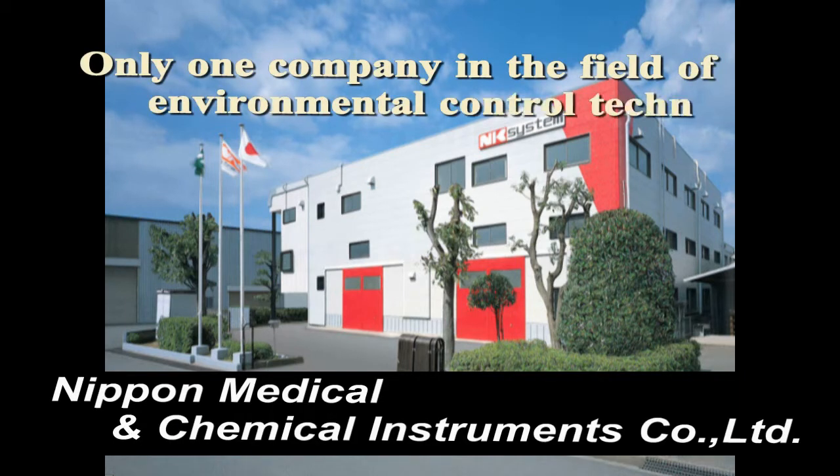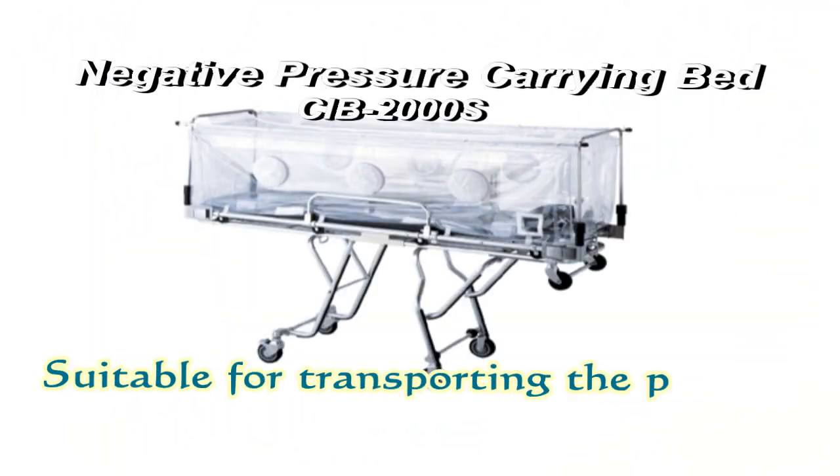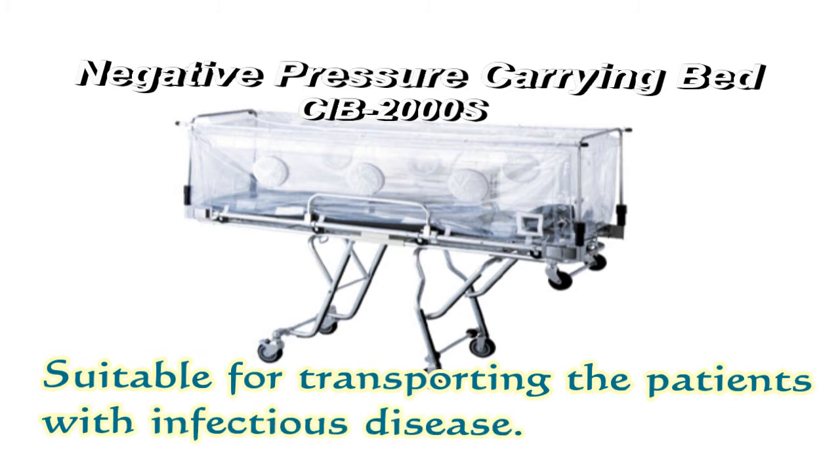Only one company in the field of environmental control technology, Nippon Medical and Chemical Instruments Company Limited, developed the negative pressure carrying bed, which is suitable for transporting patients with infectious disease.